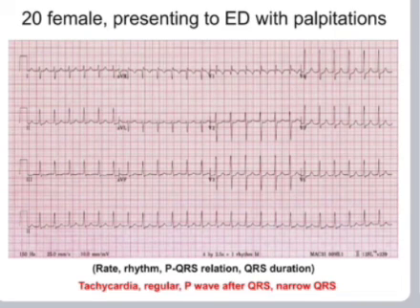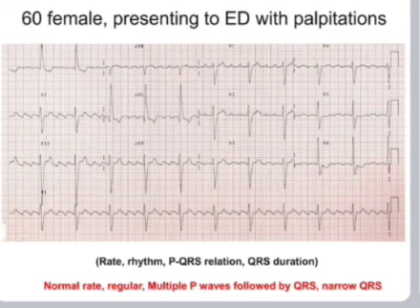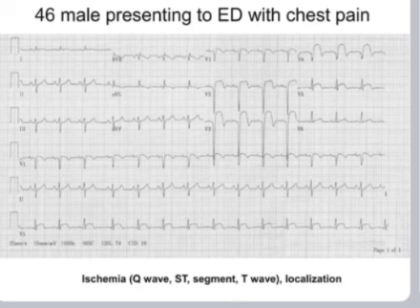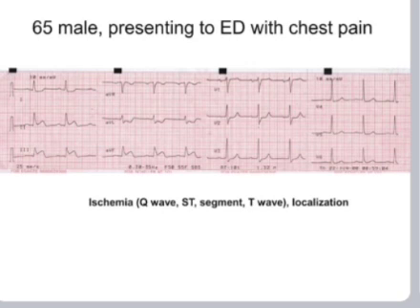Case 3: Regular rhythm with normal rate, multiple P's followed by QRS, and narrow QRS — this is atrial flutter. Case 4: This ECG shows Q waves and ST segment elevation in Leads II, III, and AVF, with reciprocal depression in Lead I and AVL — this is inferior MI. And that is it, thank you.